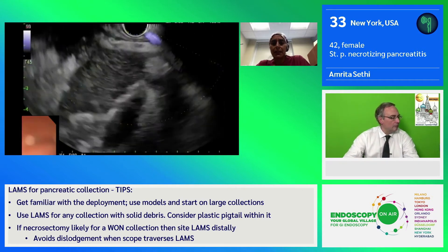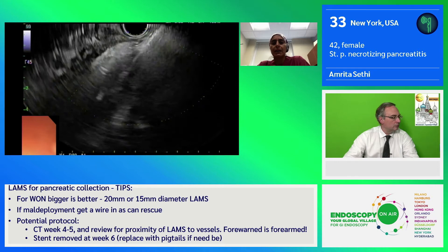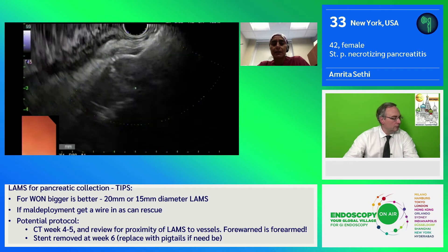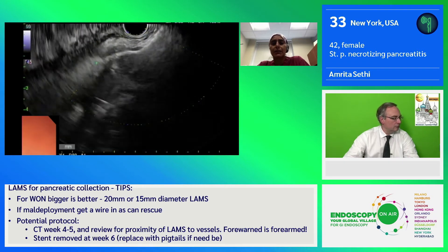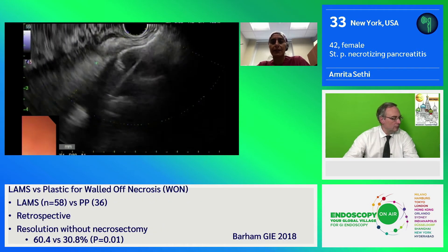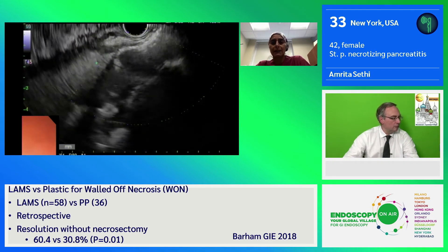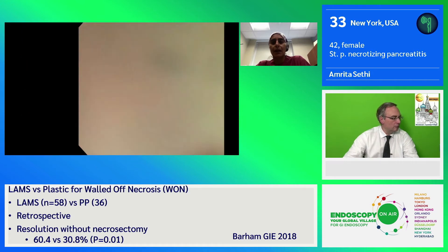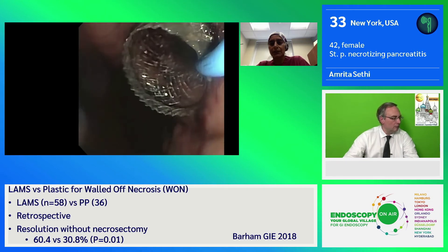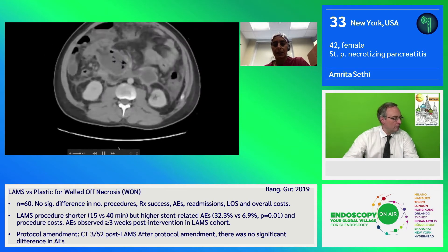We did the initial drainage using a 20-millimeter hot AXIOS catheter. You see the catheter here entering the collection, with deployment of the first flange of the stent into the collection. The second step is retraction of the catheter to allow for apposition of the cavity wall and the stomach wall. The last step is deployment of the flange within the gastric lumen to allow for drainage. You see the drainage of necrotic tissue. We then deploy a plastic stent in order to prevent occlusion and further infection.